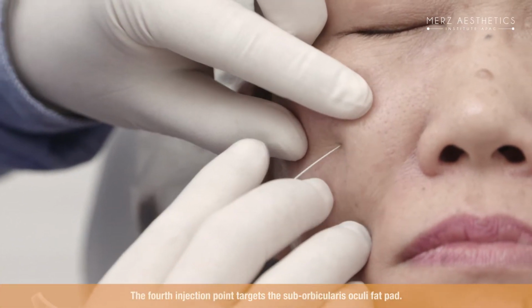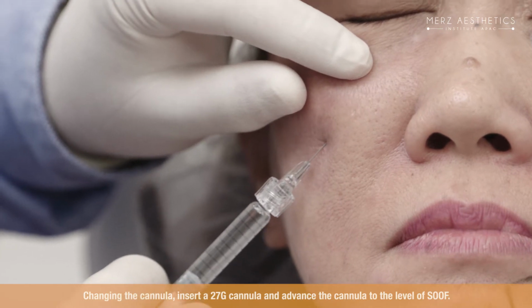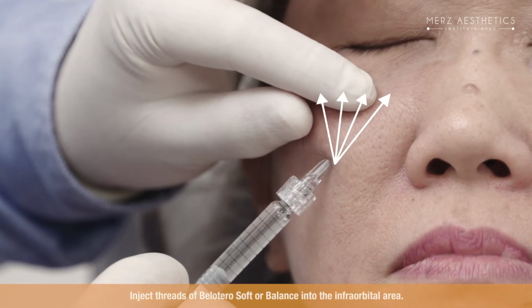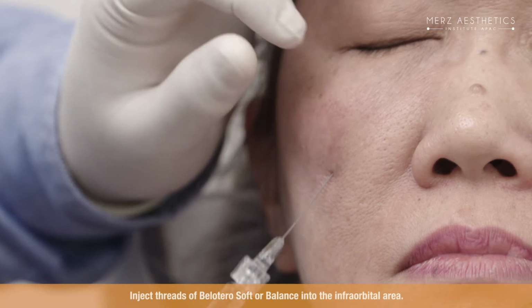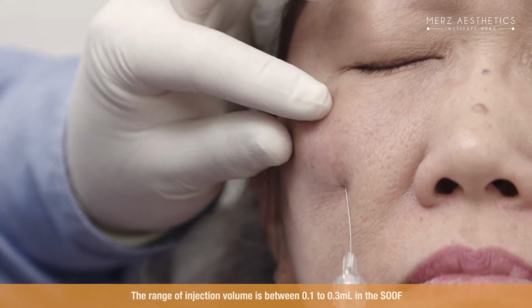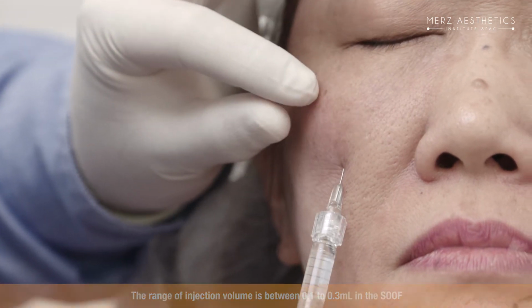The target area for the fourth injection point is the suborbicularis oculi fat pad, or tear trough area. Using the same insertion point, advance a 27-gauge cannula deep to the suborbicularis oculi fat, SOOF, and inject threads of Belotero Soft into the infraorbital area. Alternatively, Belotero Balance can be used in this region. The range of injection volume is between 0.1 to 0.3 milliliters in the SOOF. This injection creates support and takes away hollowness in the lid-cheek junction.